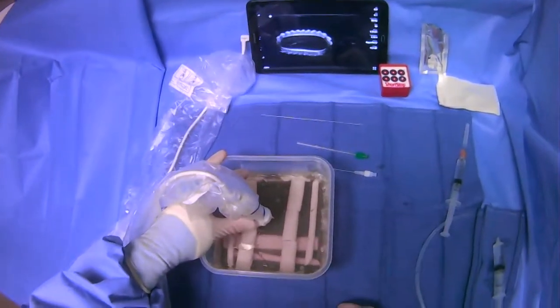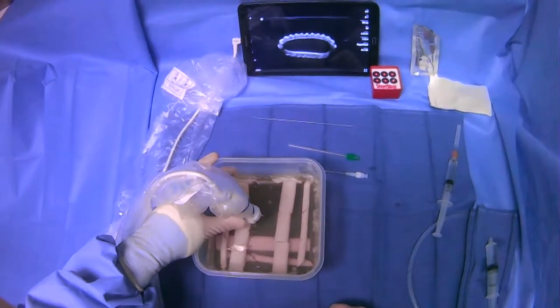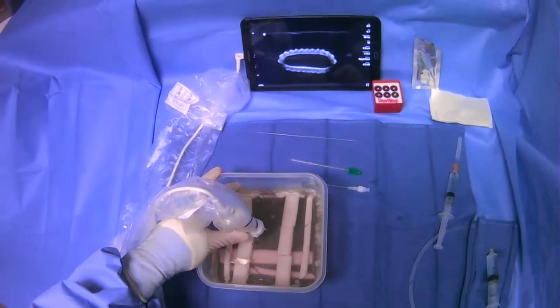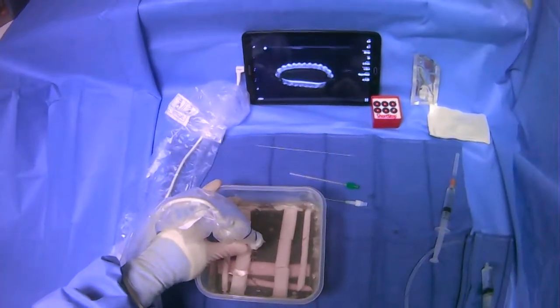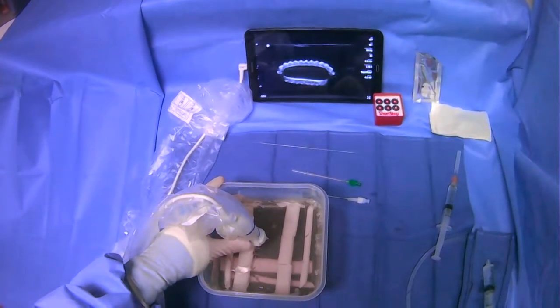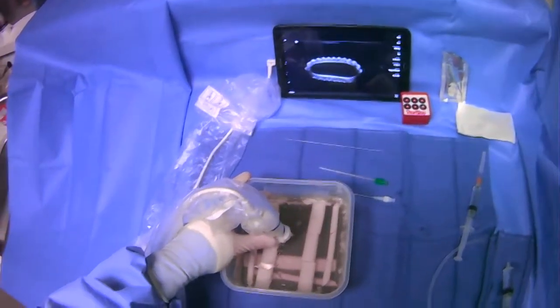We're going to go over how to use the micropuncture kit. What we're going to do here is puncture a vessel. This could be the internal jugular, it could be the femoral vein. It can be any vessel, but the micropuncture is very effective for getting access into vessels.